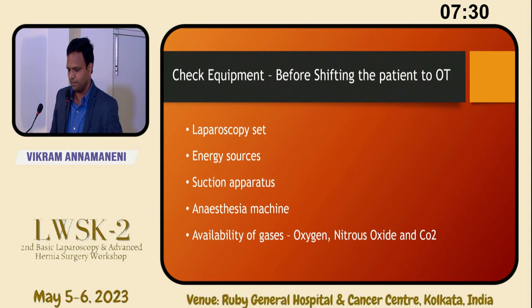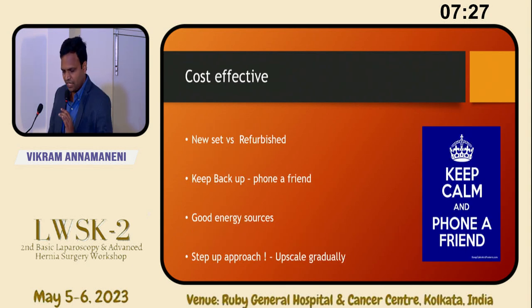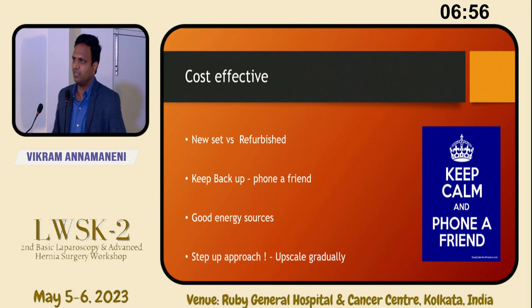Then coming to cost effectiveness, this is a common question you'll get after passing out and getting a degree. You want to buy a lap set, so which set should you buy? Is it a new set, or should we go for a refurbished one to keep the economy on track? I'm standing as an example. I bought a new set for about 20 lakhs, and in 3 months the light source failed. The same thing can apply to a refurbished one. So it's about service. It doesn't mean that if you spend a good amount of money, you'll have all good things. So you should check every system before starting the case.